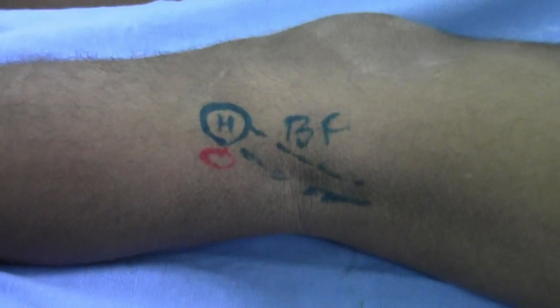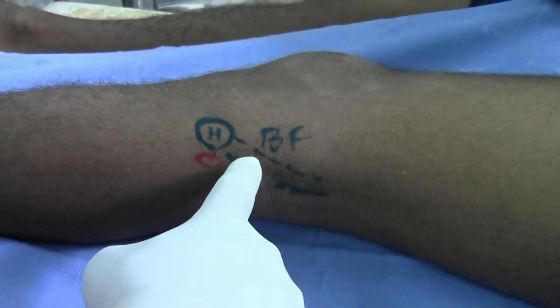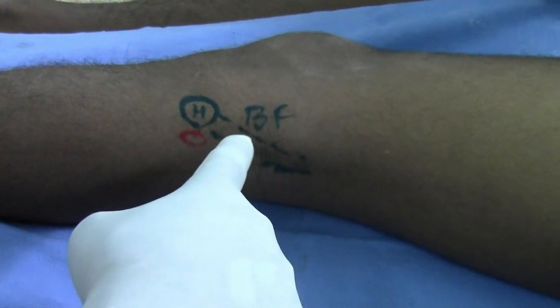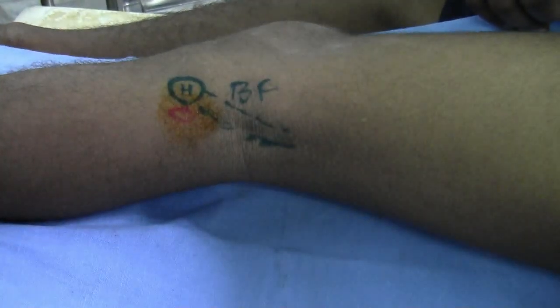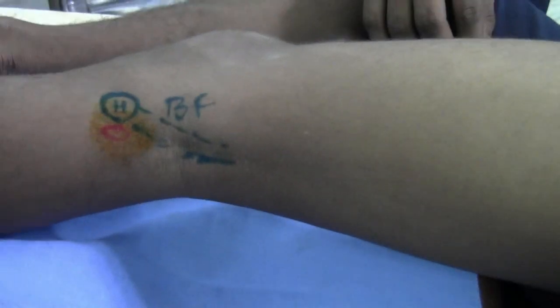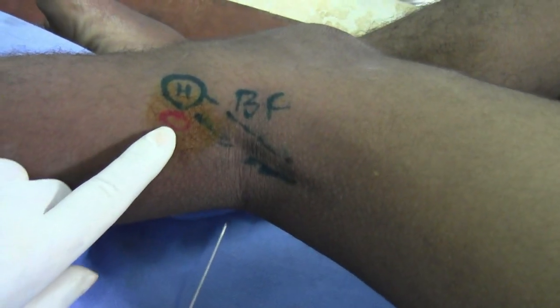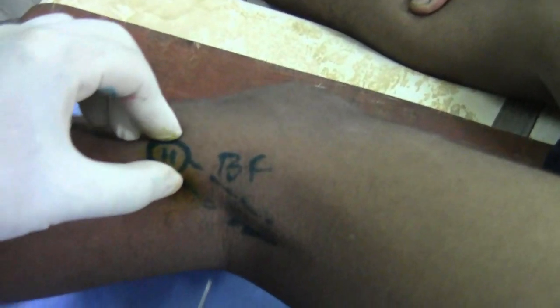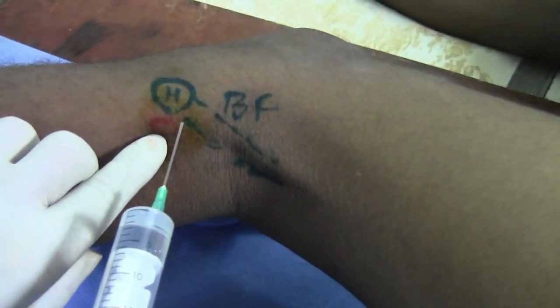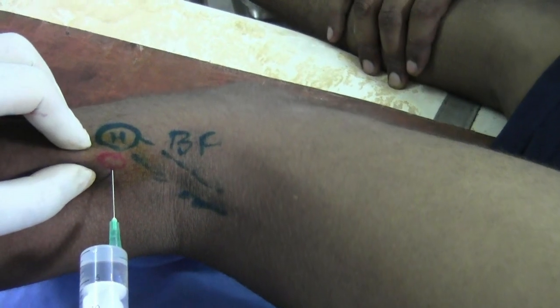At the level of the knee joint to block the common peroneal nerve, I have marked the head of the fibula. This is the biceps femoris tendon here, and just behind the head of the fibula and the attachment of the biceps femoris tendon, the red circle indicates the point of entry of the needle. Just behind the head of the fibula, you can roll the common peroneal nerve — inject 5ml of solution at this point after aspiration.